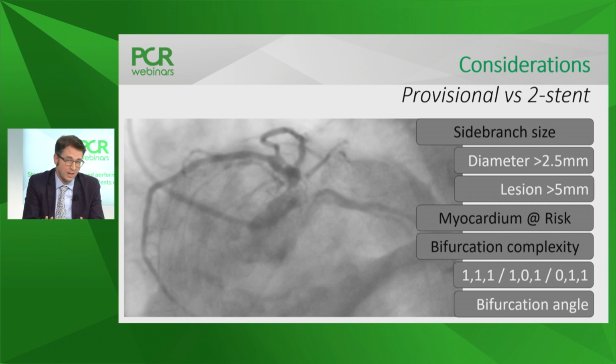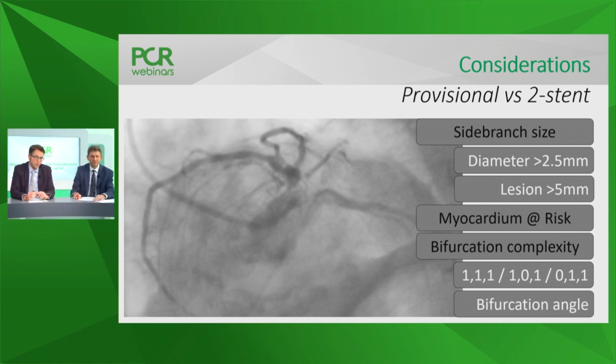And I think unless it was in true extremis, unless the patient was hemodynamically compromised, there was ongoing ischemia. This was non-ST elevation acute coronary syndrome, so this leaves you some time to properly analyze and discuss. So this gave us flexibility to think and to discuss the best options.